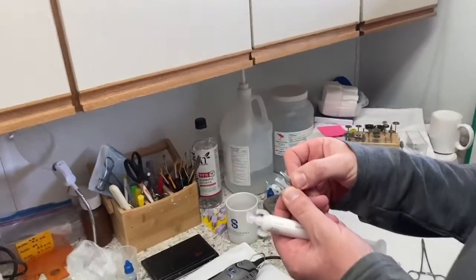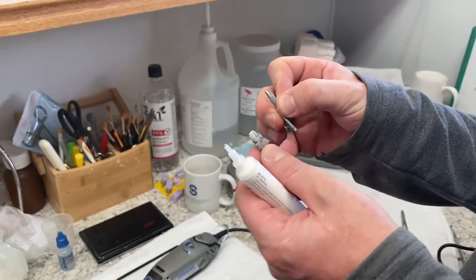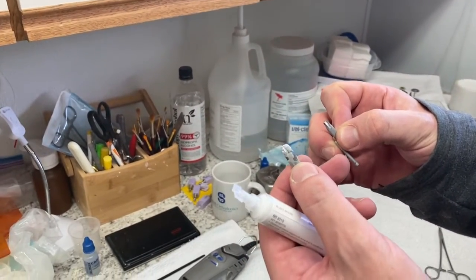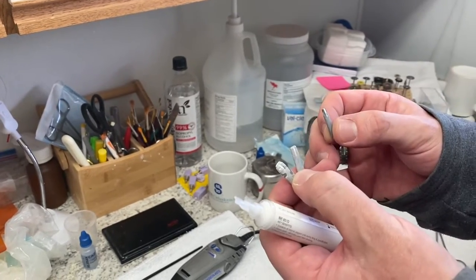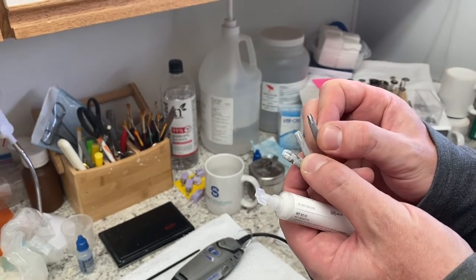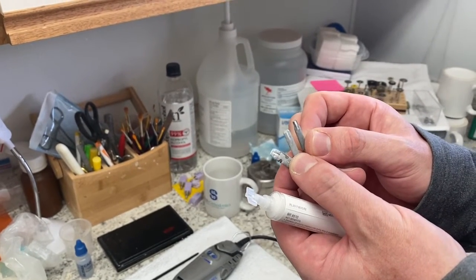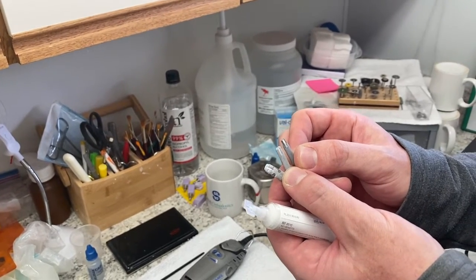Implant crowns. Okay. So we have 3 sizes of post or pegs. We have a molar, a premolar, and our home modified anterior slash implant crown, little tiny crown pegs. So things with a little tiny opening.